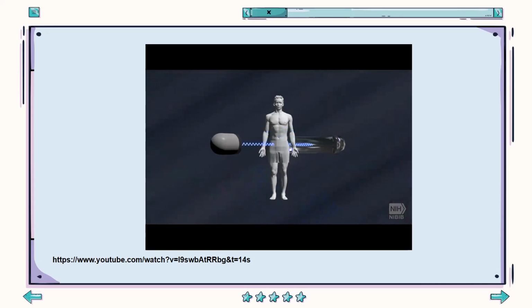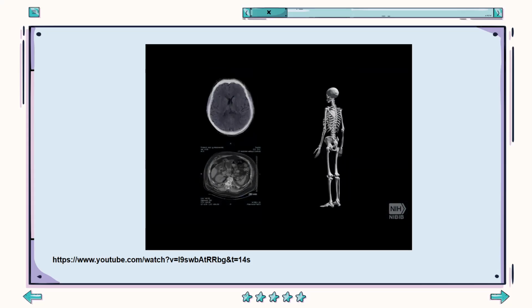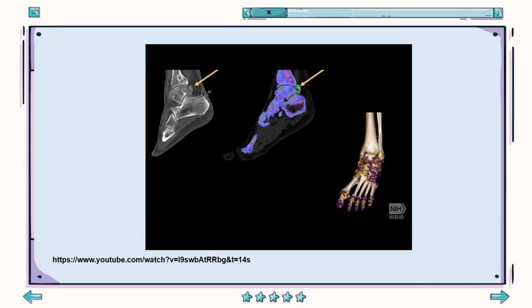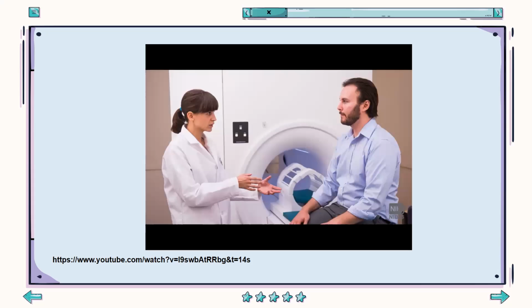There are special digital X-ray detectors located directly opposite the X-ray source. As the X-rays pass through the patient, they are picked up by the detectors and transmitted to a computer. Image slices can either be displayed individually in 2-dimensional form or stacked together to generate a 3-dimensional image that can reveal abnormal structures or help the physician plan and monitor treatments.